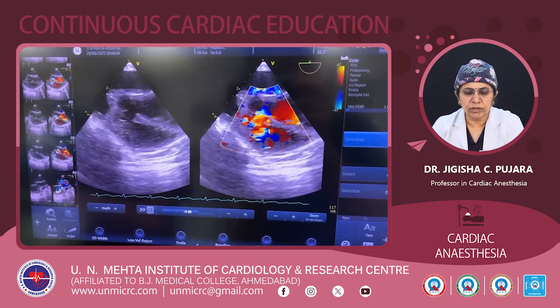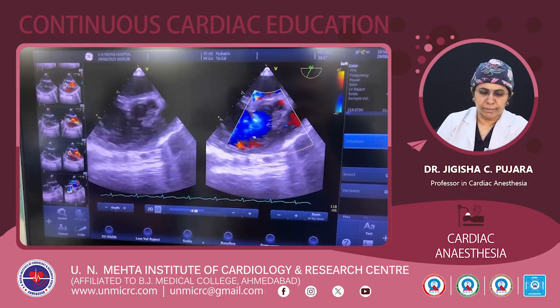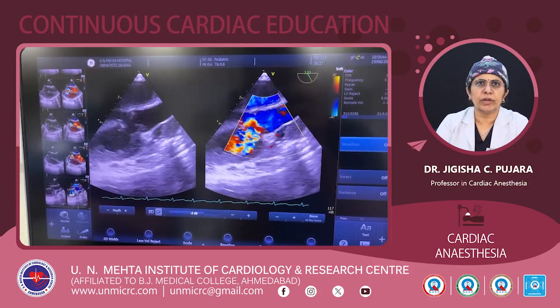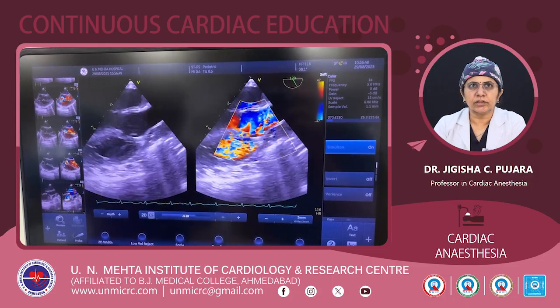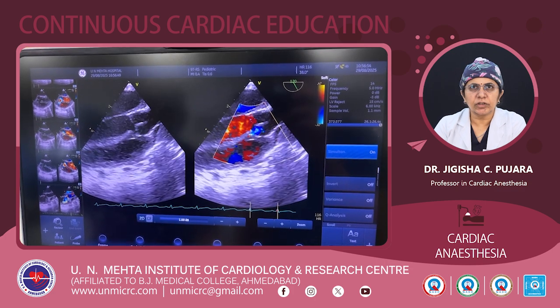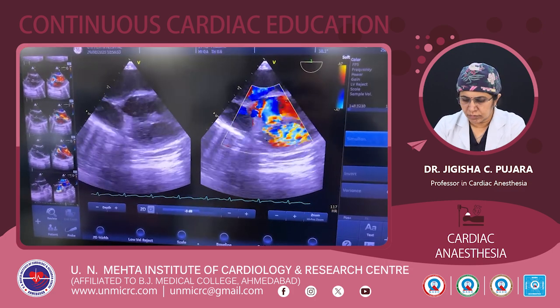Here you can see a video of the VSD showing a perimembranous VSD. You can nicely see it at 0 degree and in the long axis, and interrogation with spectral Doppler is also possible.